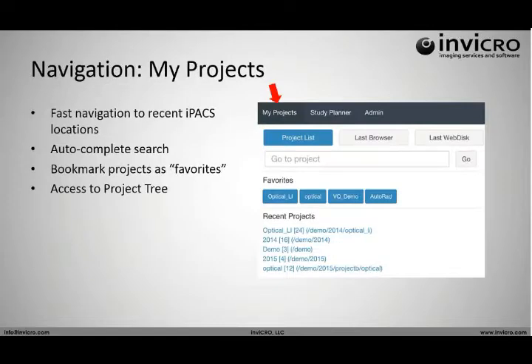And then moving on from that, the top menu that I was talking about earlier is no longer a browser web disk page. You just see my projects and a quick navigation there. We still have the traditional project tree, which is this project list. We've removed that, having heard a lot of complaints over the years about having to click down the fly menu of browser, project, subproject, subproject, subproject.